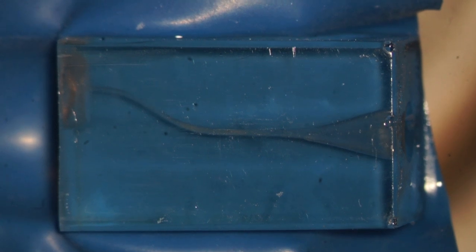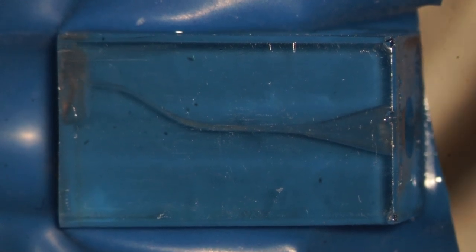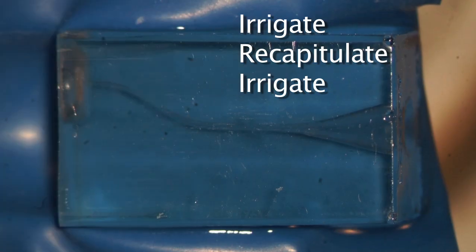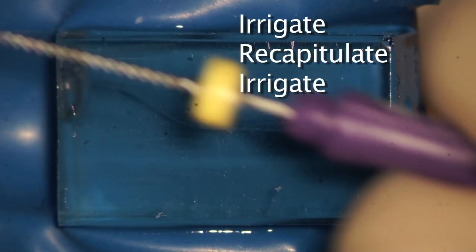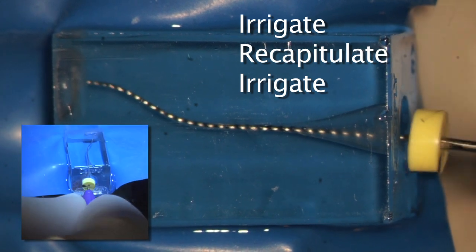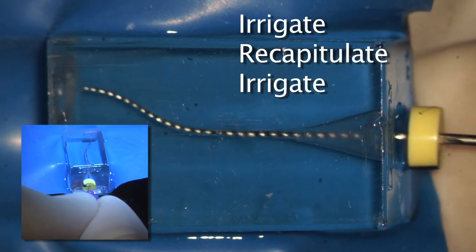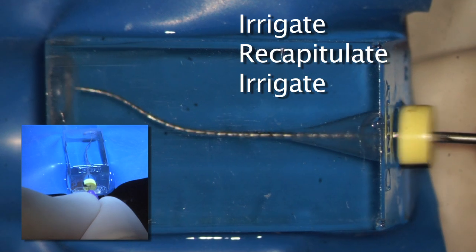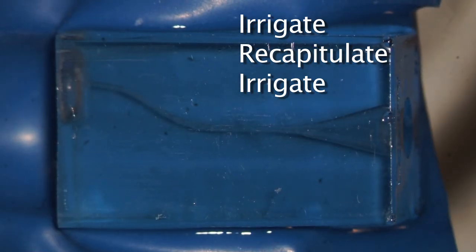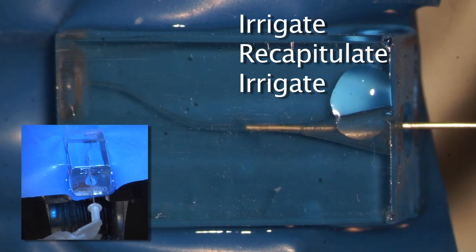Now remember, every time we remove a mechanical file, we really want to make sure that we irrigate and flush the canal out. We want to recapitulate with a small-sized hand file, in this case it's a ten hand file, and make sure the canal's patent. No debris should be accumulating towards the terminus, and then re-irrigate to liberate any residual debris that is inside the canal.